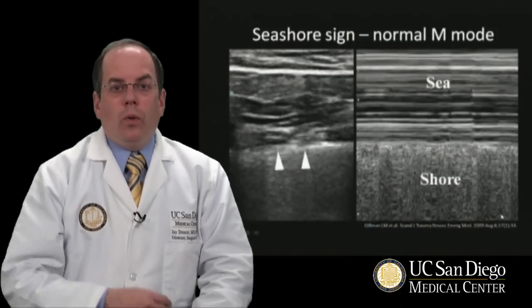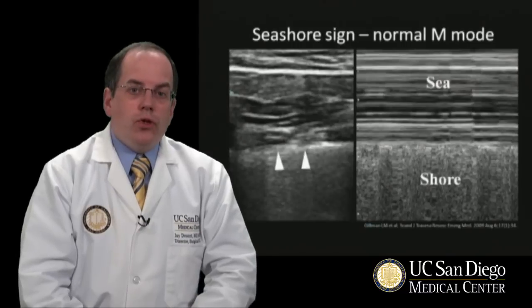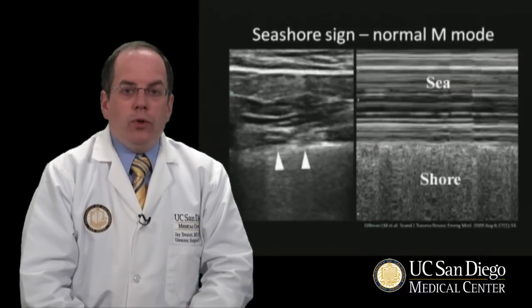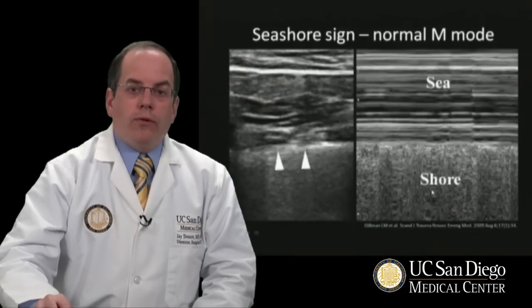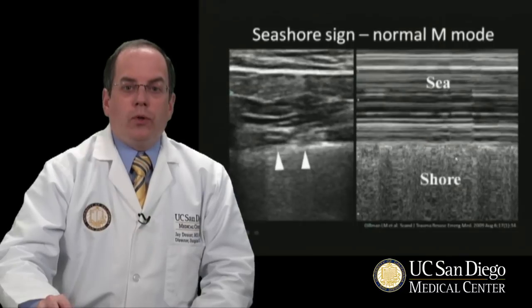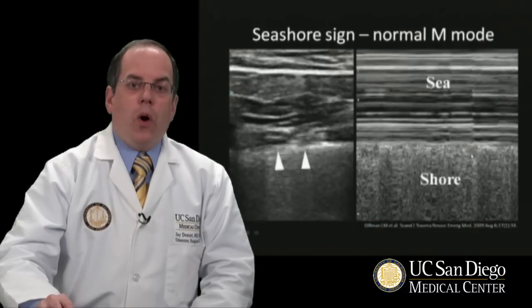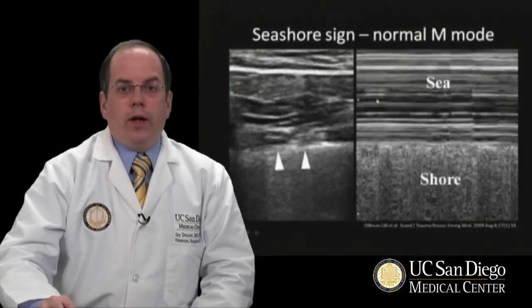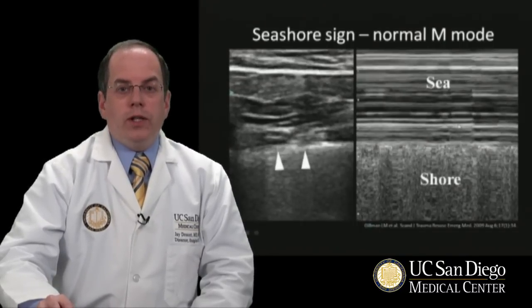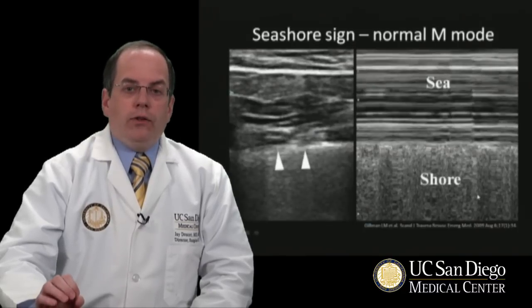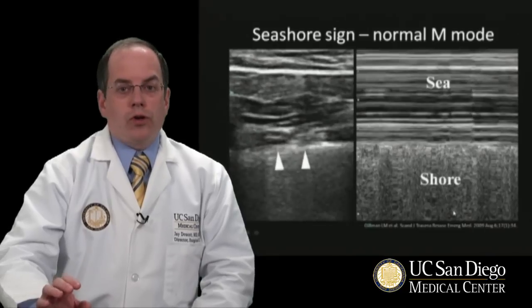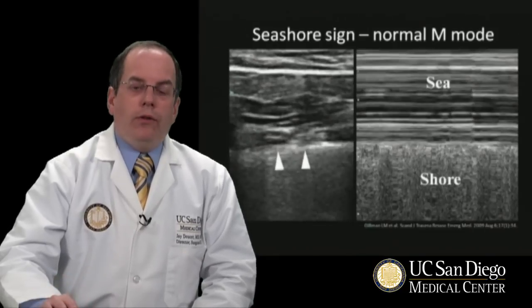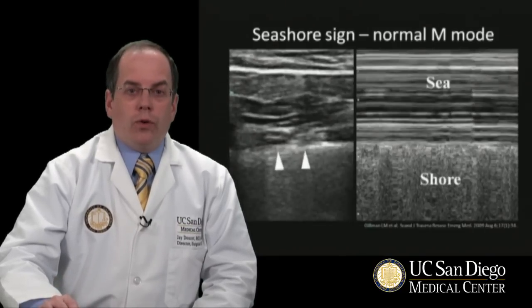If you want an extra way of looking at this, you can use M mode. Over time you'll see that the motion of the lung in the far field has a granular appearance. This is called the seashore sign, whereas the layers of the chest wall appear to be the sea or waves, and this granular sandy appearance is the actual motion of the lung in the far field — the shore. So if you see sea over shore, this is a sign that there is in fact no pneumothorax present.